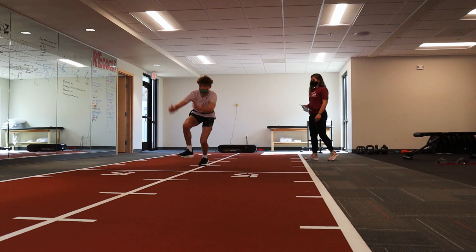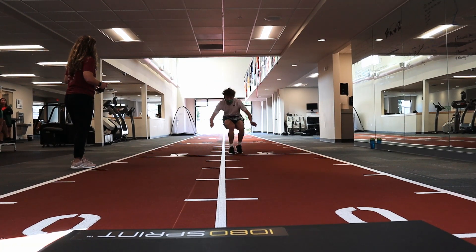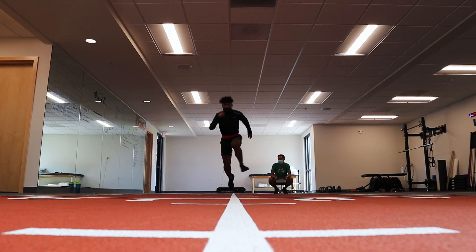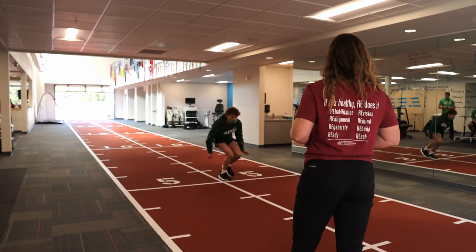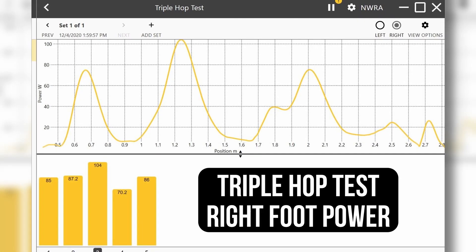We use the hop testing as we're getting athletes ready to return to sport, especially with a lot of my ACL athletes that had ACL reconstructions. That's been really beneficial because we know that athletes are able to compensate, and I think that's one way the 1080 really helps. We can look at power production — are you as powerful on your right leg as you are on your left? Just because you can hop the same distance doesn't mean that you're doing it the same on each leg.